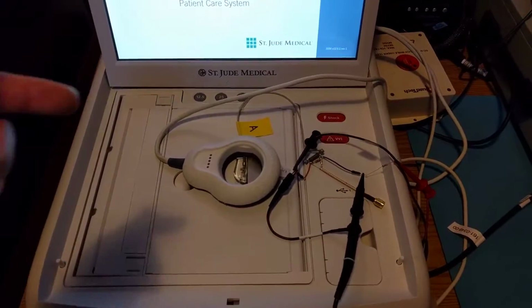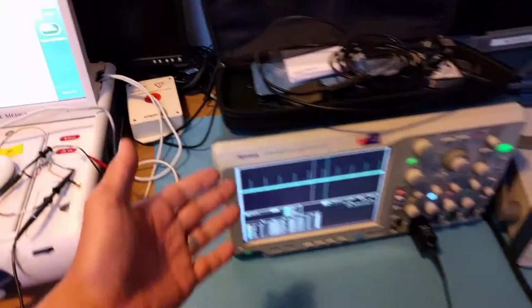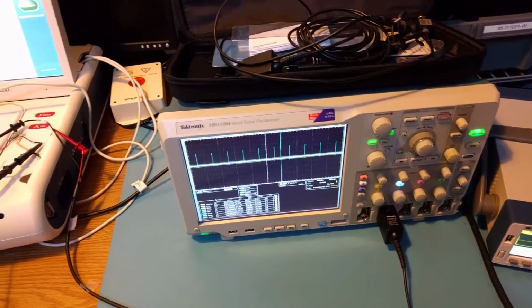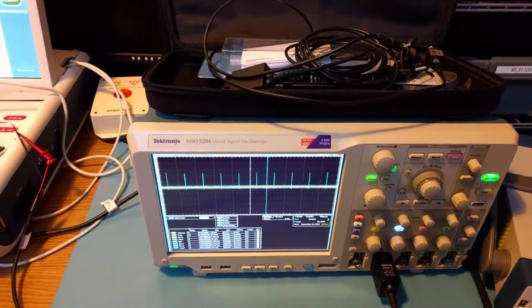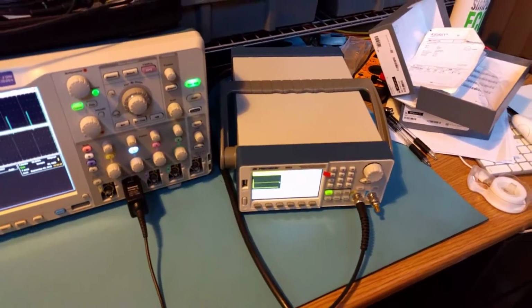This is a setup with the pacemaker and the measurement apparatus that we talked about before, including the oscilloscope that's measuring a nice pacing signal at 2.4 volts in exactly 60 beats per minute. And this is our simulated cardiac signal, which is off for now.